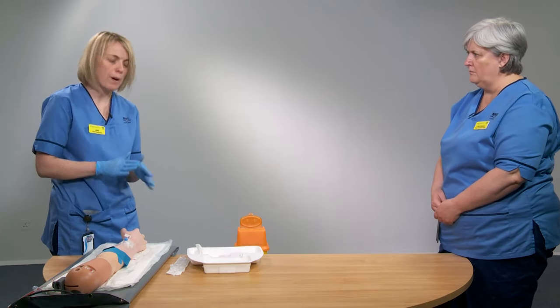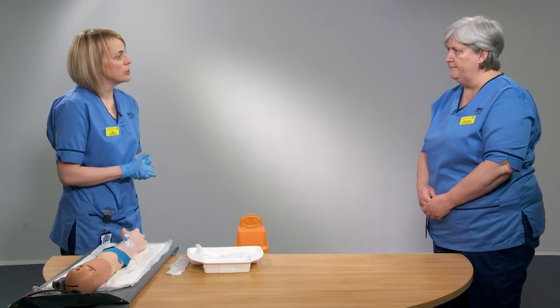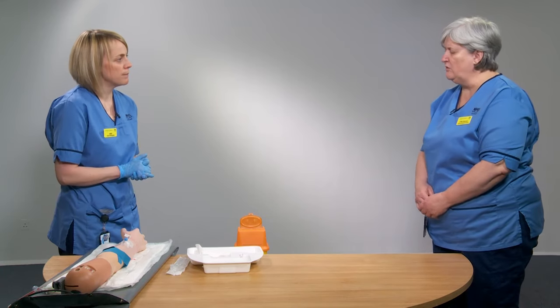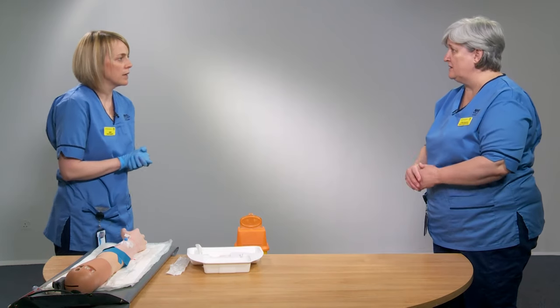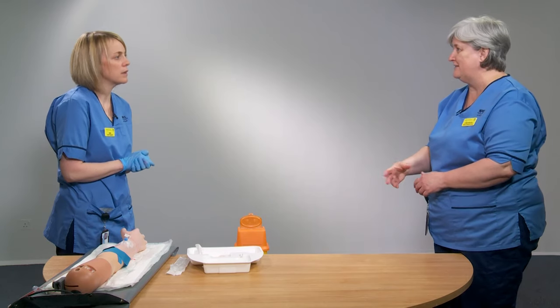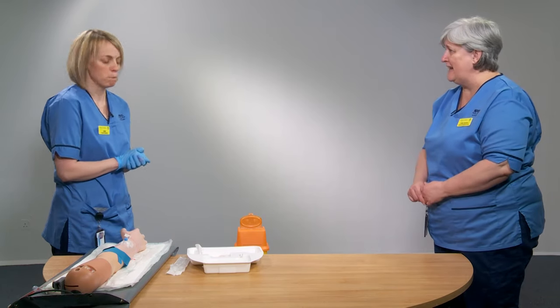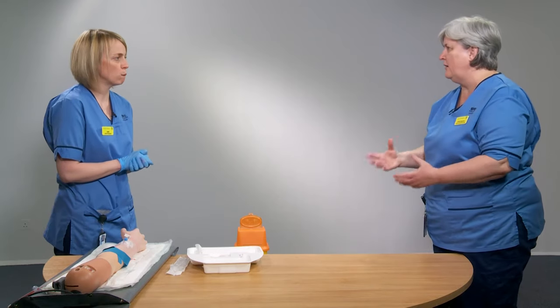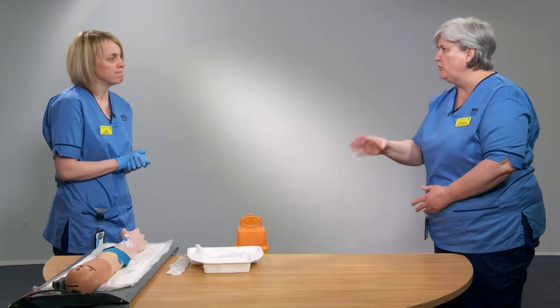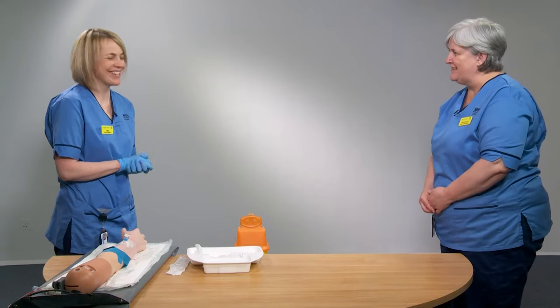Thank you — do you have any questions about that process? No, just a few things that are quite similar to the venipuncture: the 30-degree angle, the lattice pattern for cleaning, and tipping the skin to tension are all the same. But there are a few more points to consider when doing cannulation — the two flashbacks, advancing the cannula off the needle, the priming, and the push-pause flush technique. Thank you very much, Kate.